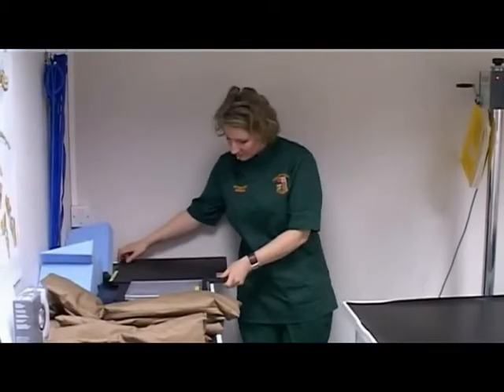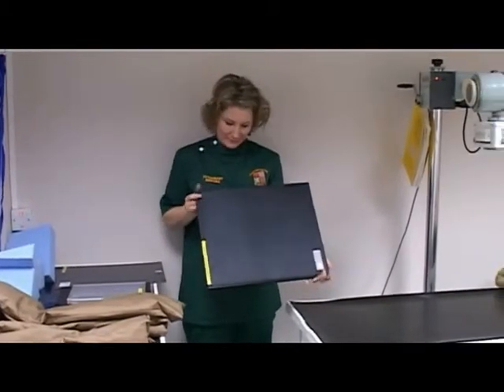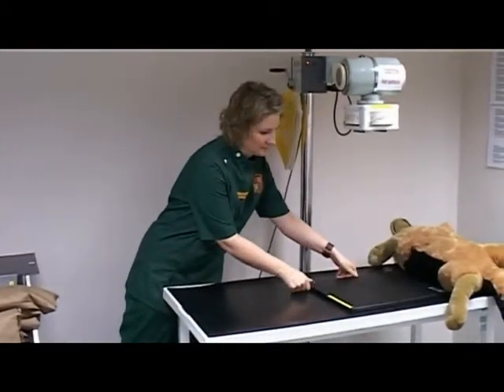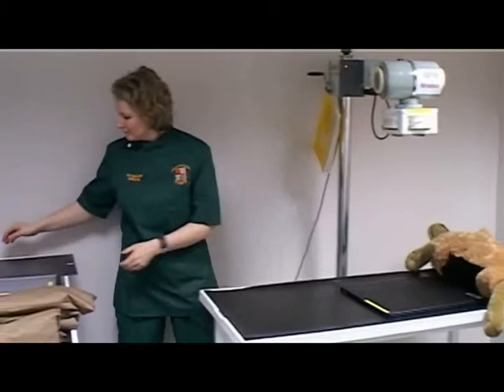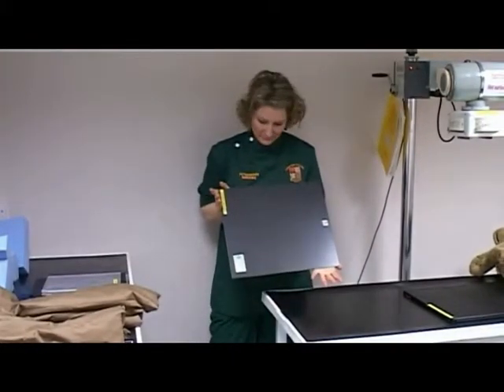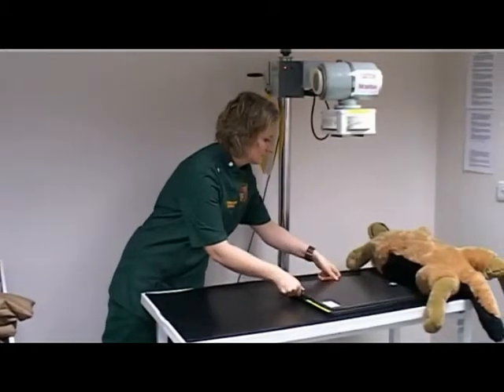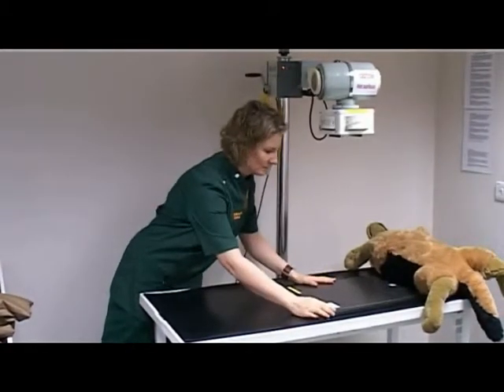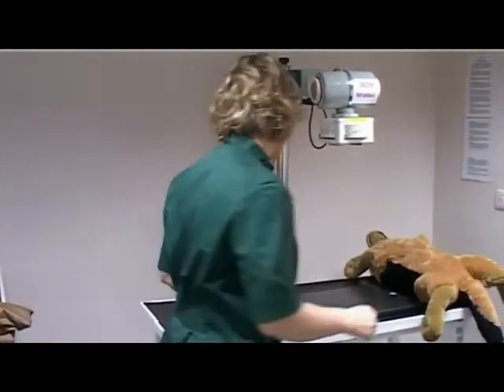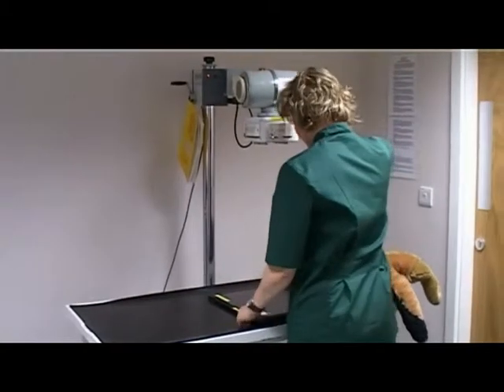Select a large-sized cassette and place it the correct way up on the table. Select an appropriate-sized stationary grid and place it exactly on top of the cassette, ensuring it is the correct way up. Collimate to within the edges of the grid.